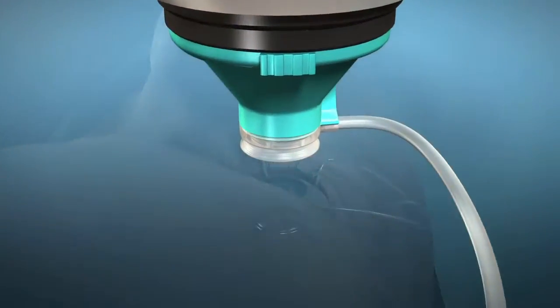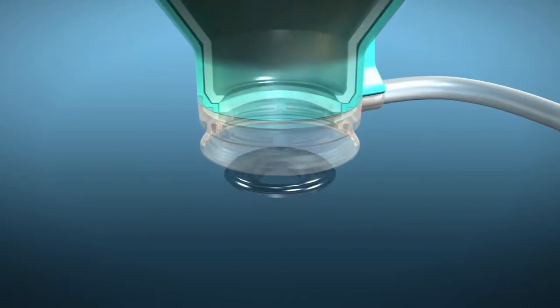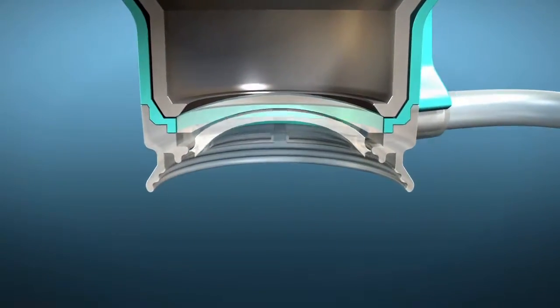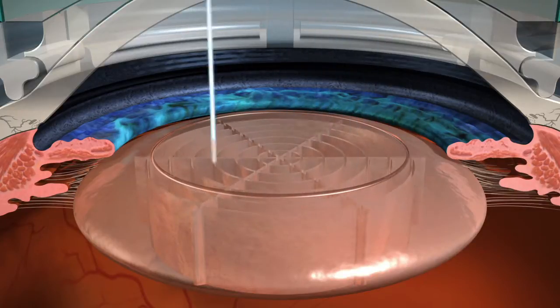With many technology advancements in cataract surgery, surgeons have options that allow patients to make informed decisions on how their cataracts will be removed. One such advancement is the LensX laser.